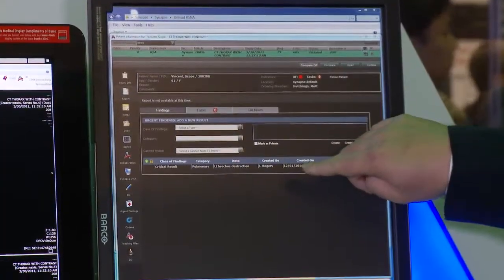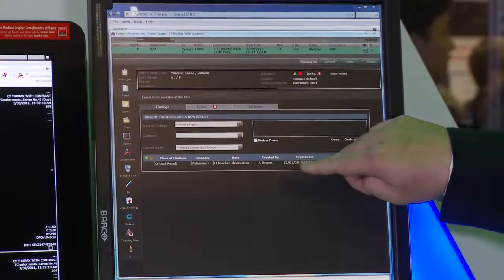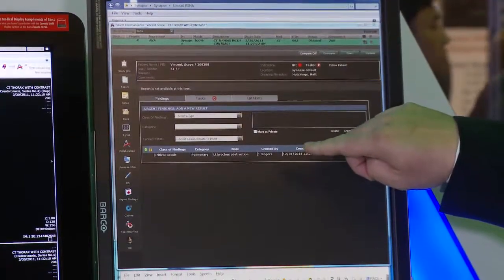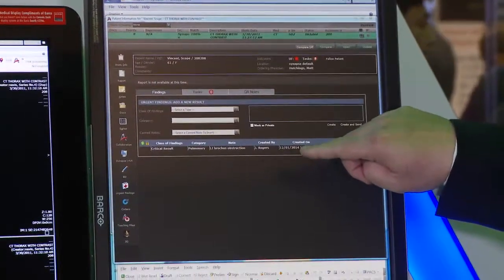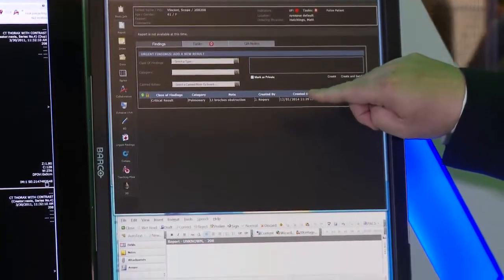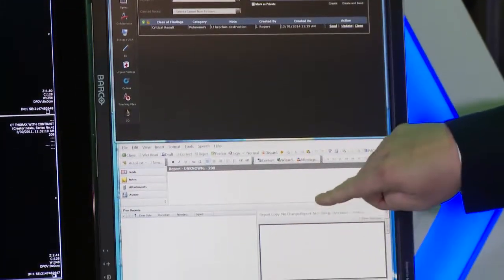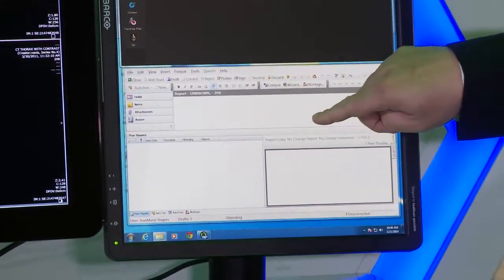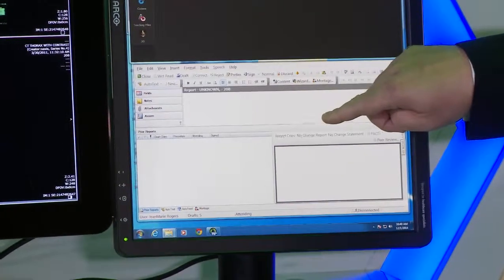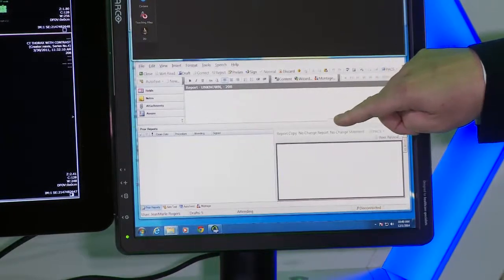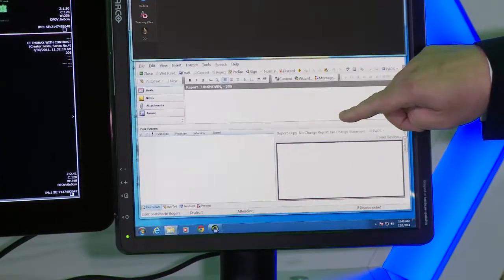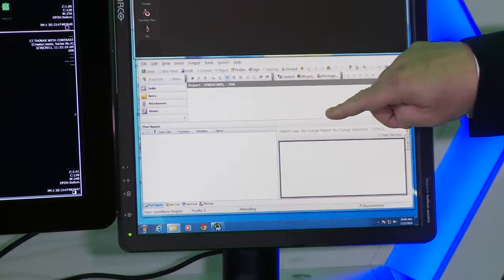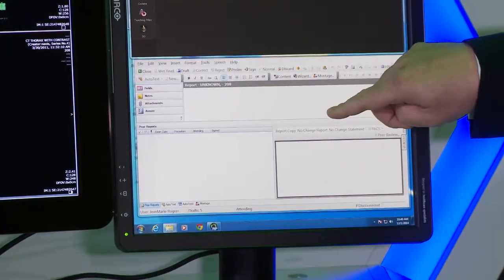Here you see the new Synapse Communications product in the power jacket, which has ED findings, critical results, peer review, task workflow, and a new pulse tracker. You also see on the same screen an example of our new integration with Nuance PowerScribe, which is a bi-directional integration allowing us to ensure the report that you're indicating for this study is the same as the view of the imaging area.